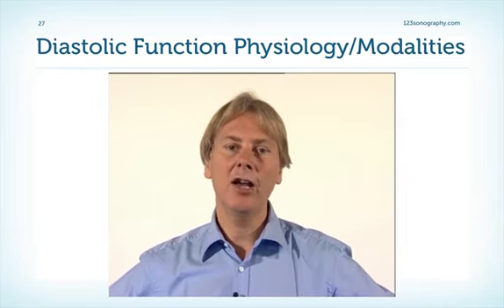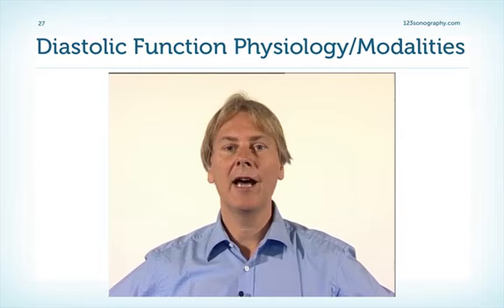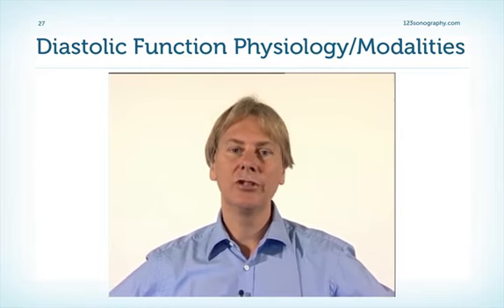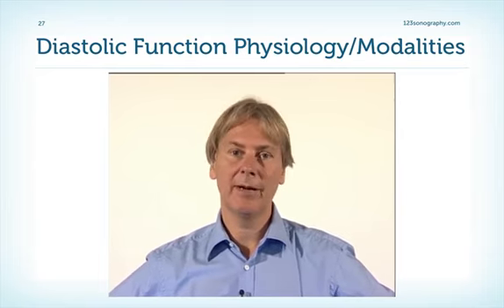So you see the physiology behind diastolic dysfunction is not that complicated. And even though we have 4 different modalities, we usually only use the mitral valve inflow and maybe the tissue Doppler of the mitral valve annulus.